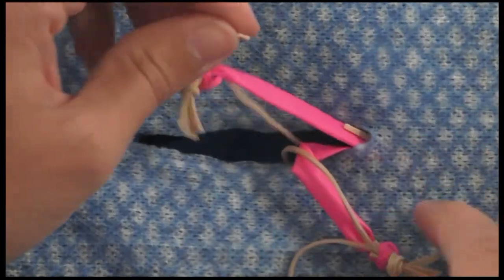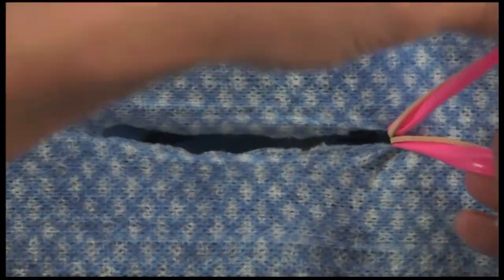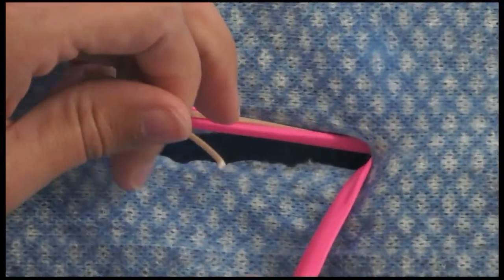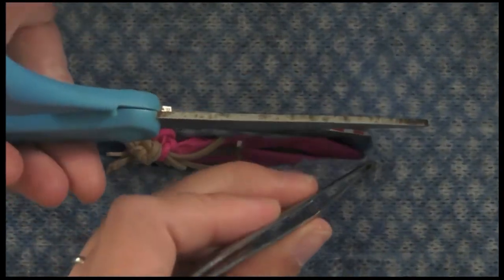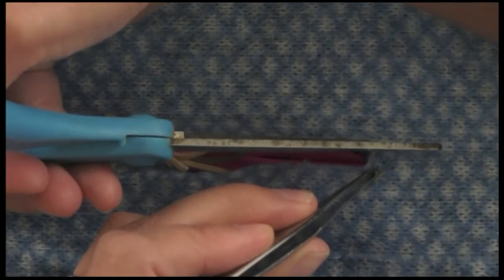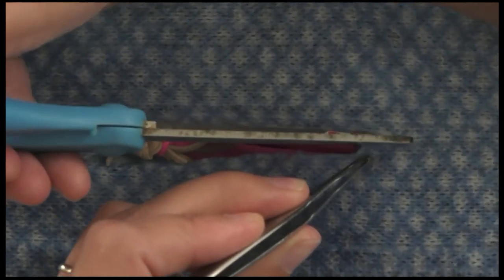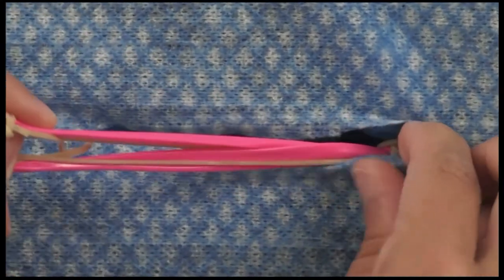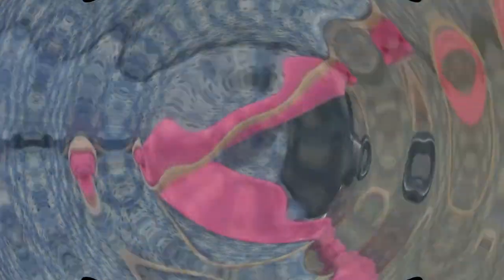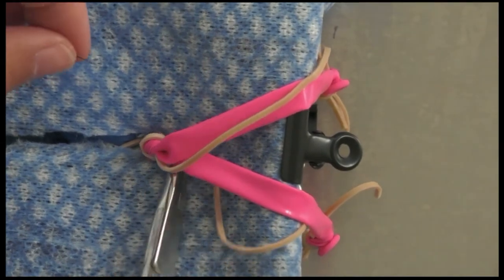Reflect the uterus caudally if you can. If you don't have enough room to see everything, extend your incision caudally — this is absolutely something you can and should do in real life if you can't exteriorize everything. Extend that incision, reflect the uterus caudally, and then you're ready to apply your two ligatures.